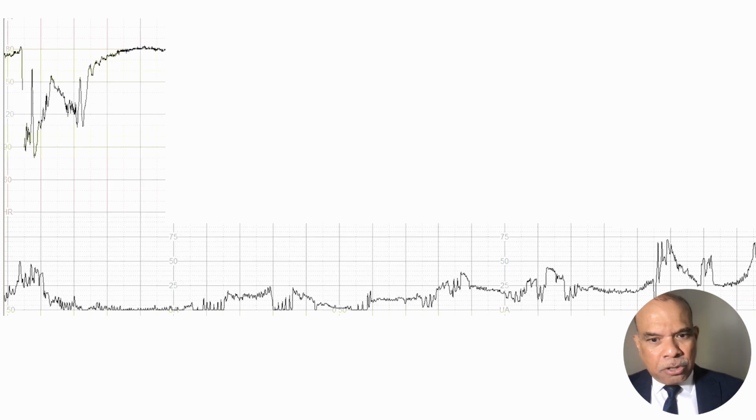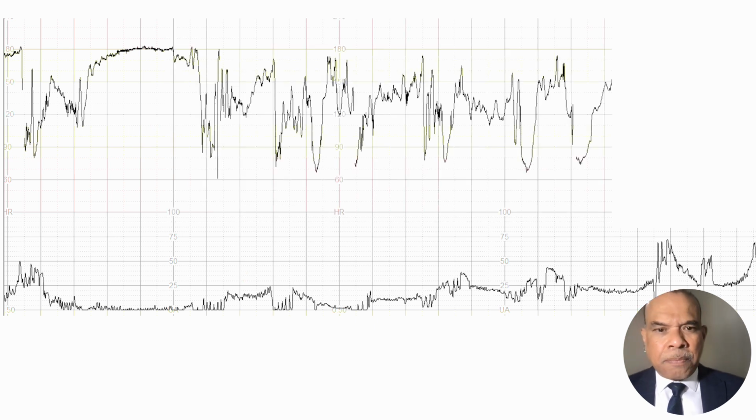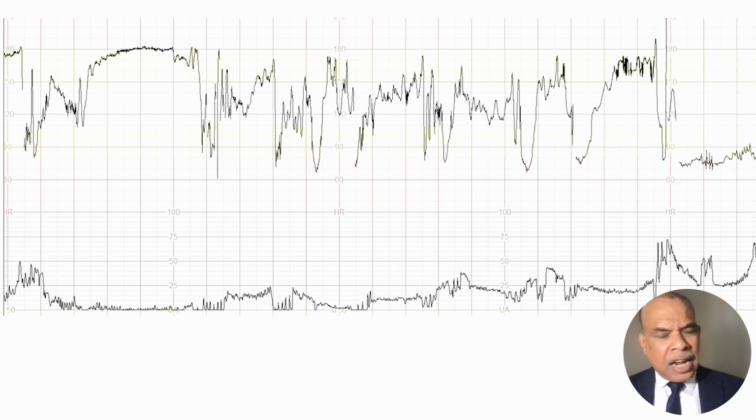I have an acute hypoxia. So here you can see it's a gradually evolving hypoxia with reduced variability, so decompensated. And then if you start the same movement to start pushing, it changes into subacute hypoxia, and if you're not careful, the same fetus goes into acute hypoxia.